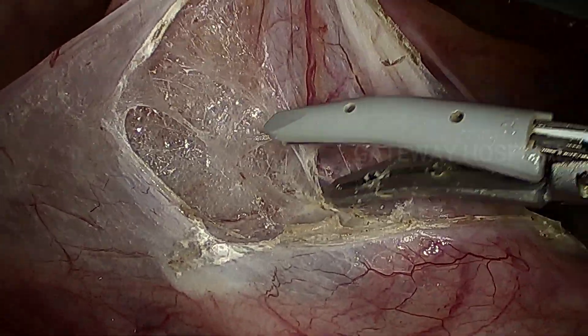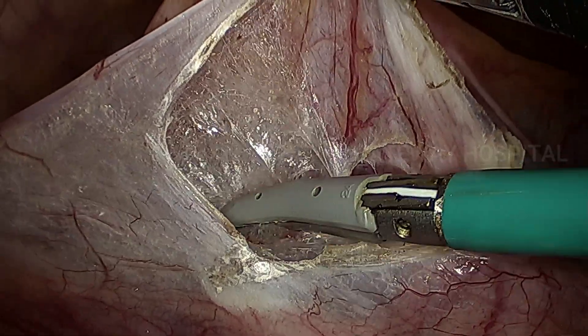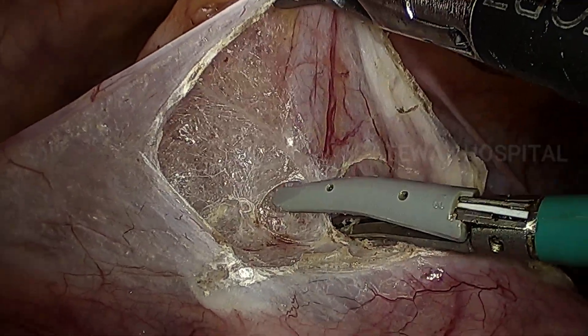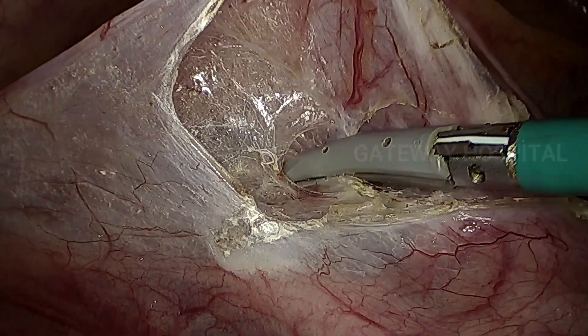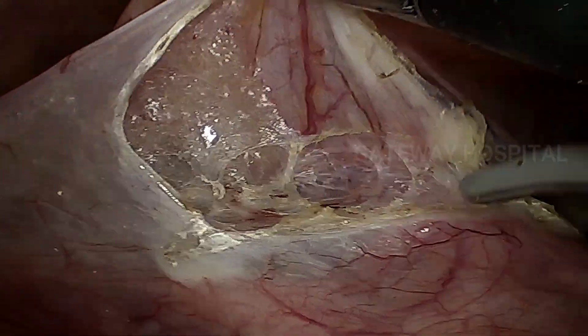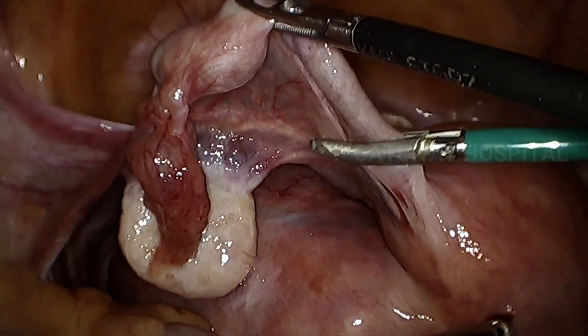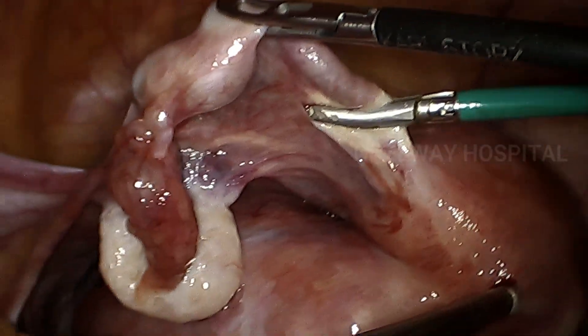You can extend the incision up to the left round ligament. It is a U-shaped incision starting from the right broad ligament, going across the UV fold of peritoneum, and ending at the left round ligament.